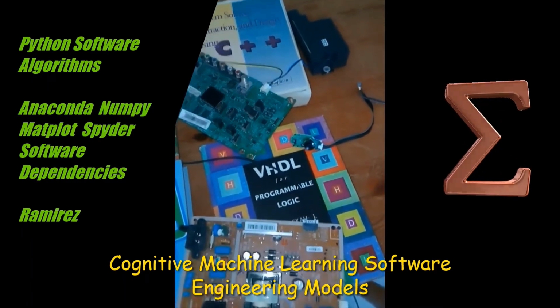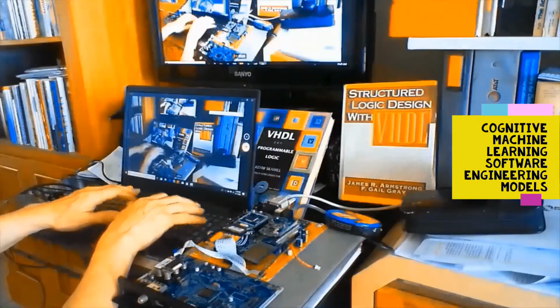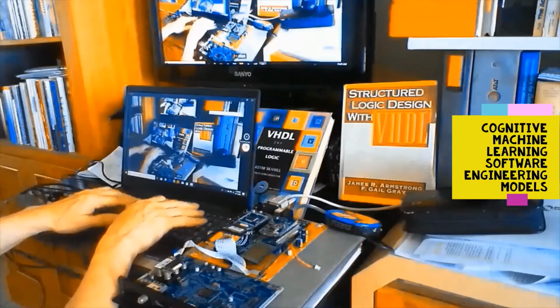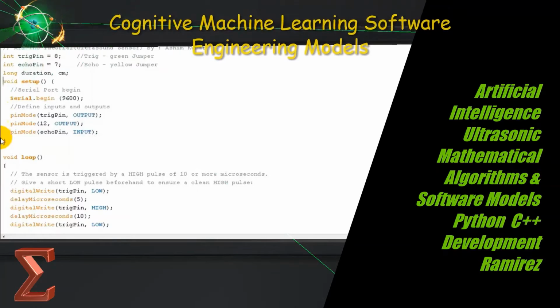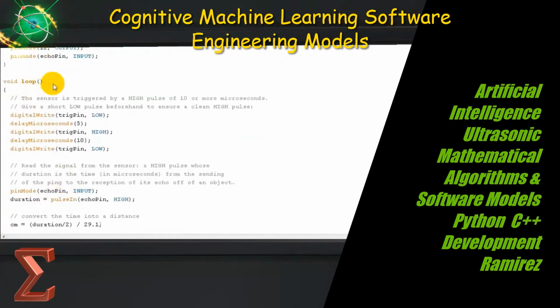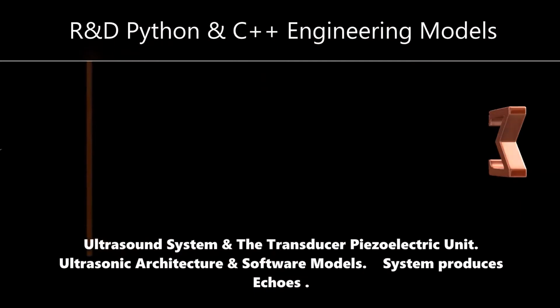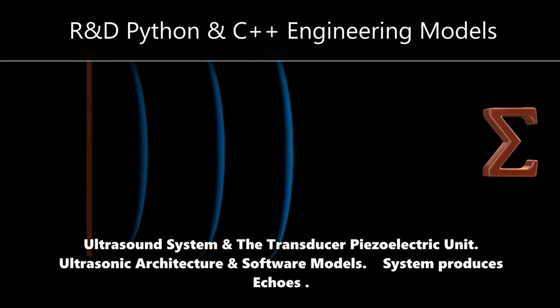Ultrasound probes, called transducers, produce sound waves that have frequencies above the threshold of human hearing, that is above 20 kilohertz. But most transducers in current use operate at much higher frequency in the megahertz range.